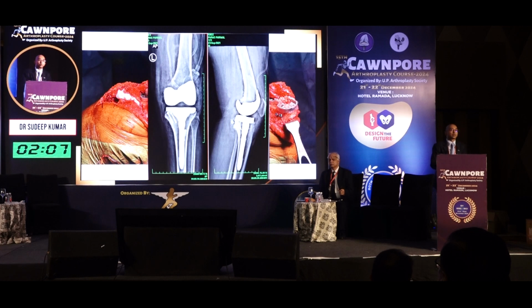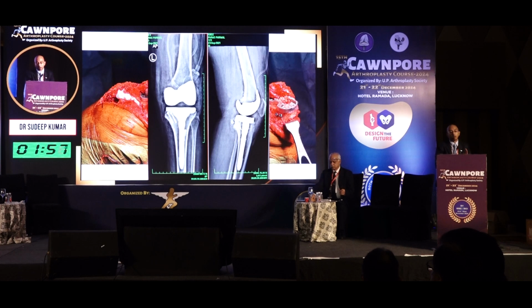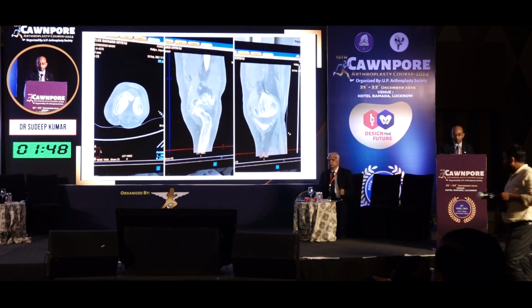And whenever you're using a screw, remember you have to bridge, you have to bypass that with a rod. You just cannot use a screw without using a rod. So remember using a rod, because I have done all those things and I've failed. So remember, if using a screw, bypass it with the rod. So just some examples.